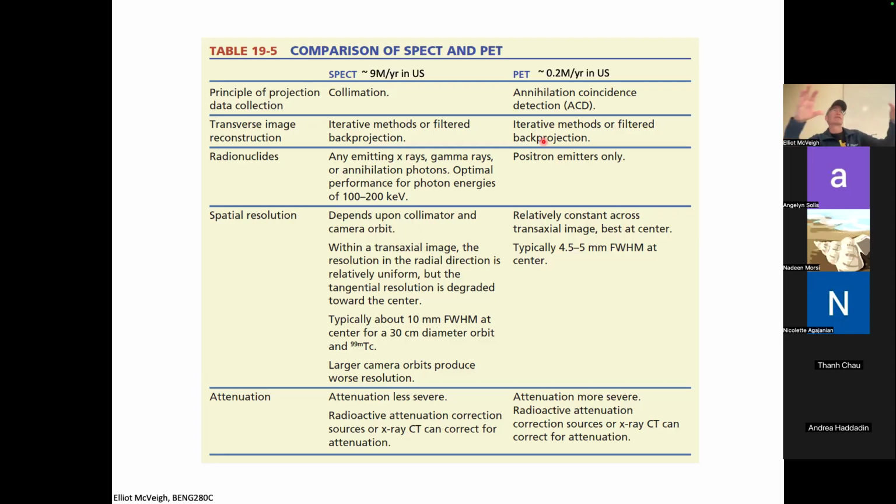And then you encode that difference and go back and change your image and do another forward model and see if you got closer. Okay, and you just do that iteratively until your forward model gives you data that looks like the best fit for the raw data you've got.